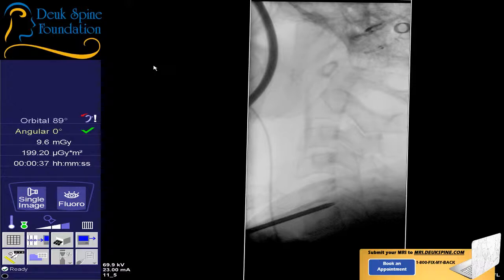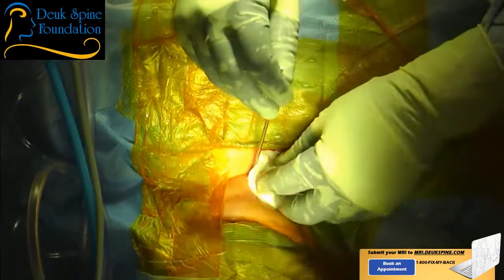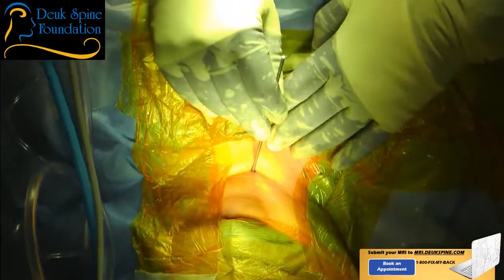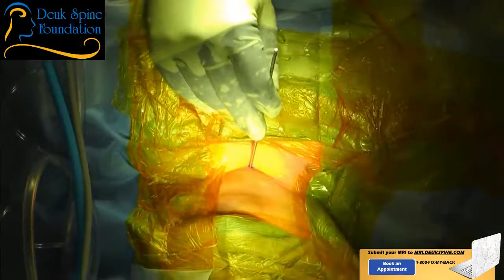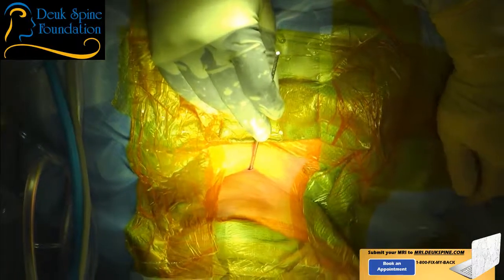So at this point, we're going to next move south. Wait, before you do that, let's get the Coker ready right here. Everything's good here. No force, no tension on that. And then we'll need some inline traction. Just gentle, very gentle, nothing significant. It's about 5 pounds, maybe 10. All right, now Luis will get positioned, and the last person to come in will be Jordan.